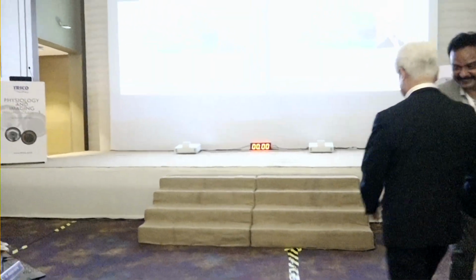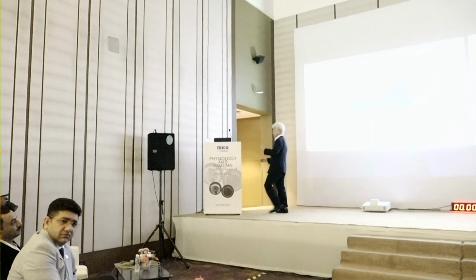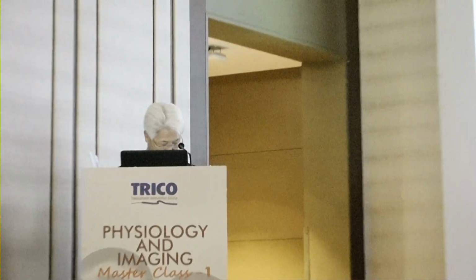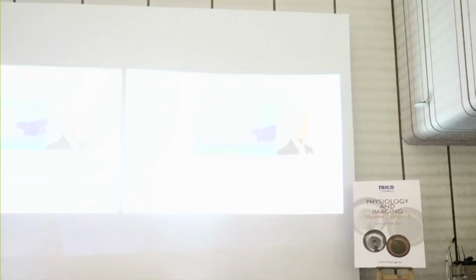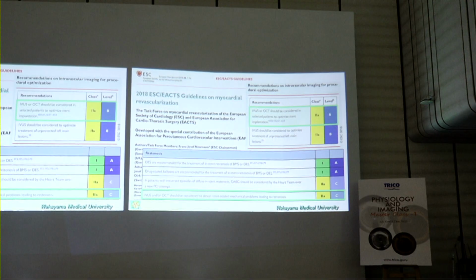Dr. Akasaka. Stent failure on OCT imaging is a very, very hot subject. And I think Dr. Akasaka has done a good amount of original work. So, thank you. Yeah, please. Thank you, Dr. Patel, for the kind invitation. And this is my disclosure.